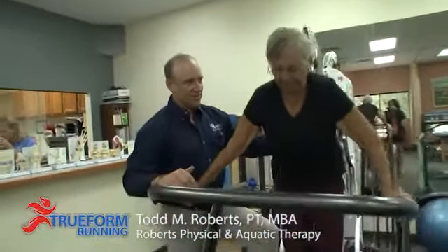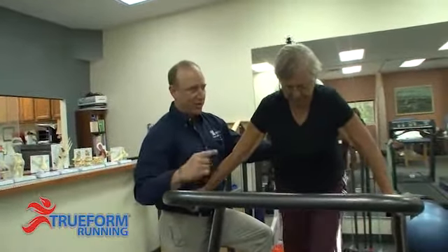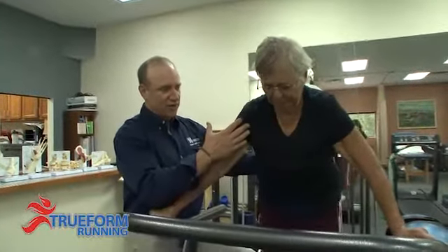In comparison to the flat treadmill, if the patient doesn't have any control, it forces her to have better pelvic control, better balance control, and also control where her center of gravity is.